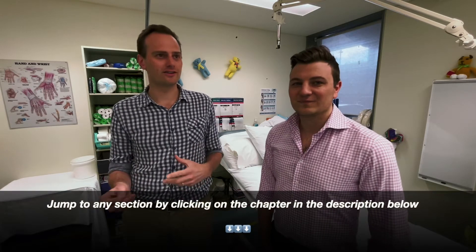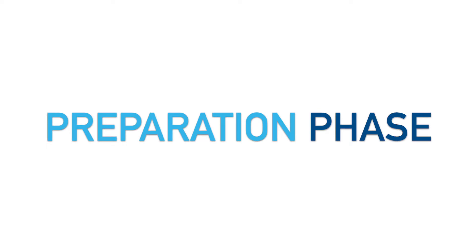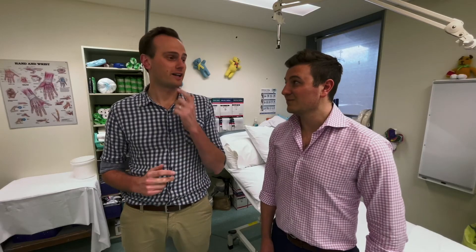Welcome back to another episode of the Osteoclast plastering series. Today I've got Nick Pultegle with me, another orthopedic registrar. This is going to be a great video because we're going to go through all the general tips we've picked up in our careers as orthopedic registrars — everything from putting the casts on, how to finesse the cast, how to make life easier for yourself.